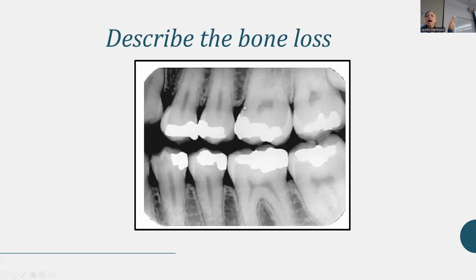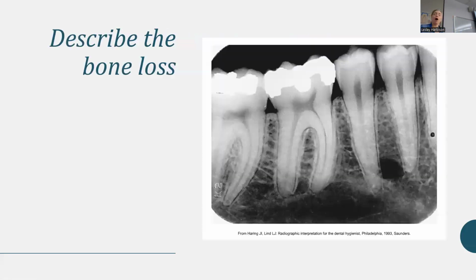But I absolutely agree with you that I can see what you're seeing. I just don't know that that's bone loss. That is the unsatisfying hard answer about doing perio at this stage with nothing else.